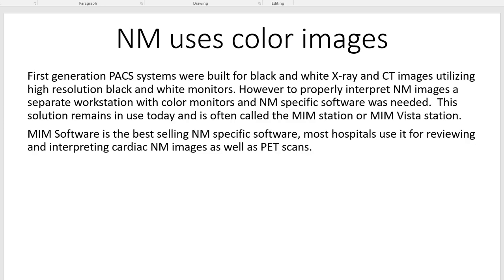But again, they're set up specifically for CT, MR, ultrasound. They don't have the color palette and the color range that a nuclear medicine workstation has. So even though we've slowly moved away from all black and white monitors to some black and white and some color, they're still not right for nuclear medicine imaging. To properly interpret NucMed images, a separate workstation with color monitors and nuclear medicine specific software is needed.